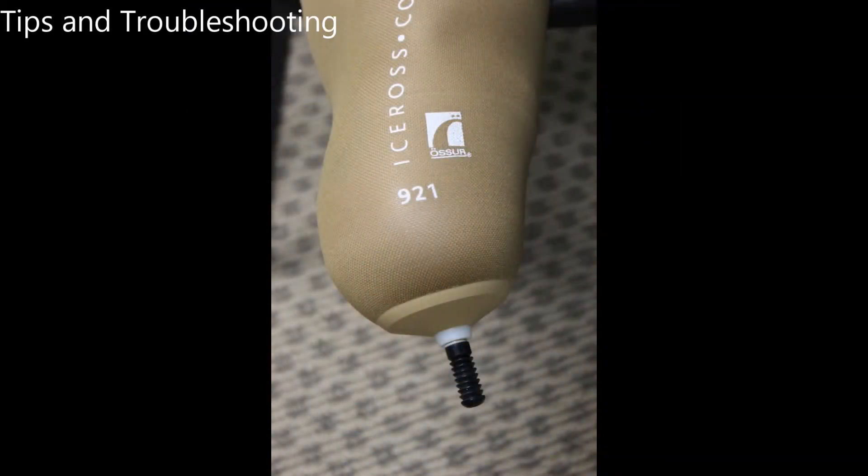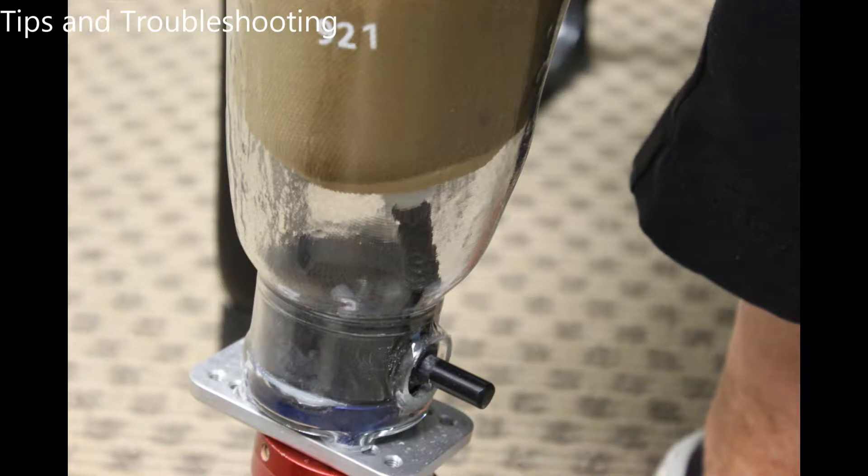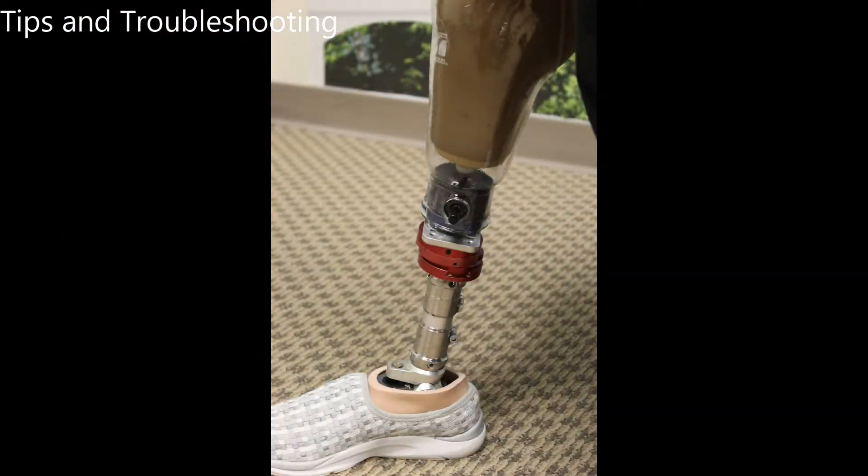If you roll on your gel liner with a pin misaligned with your leg, it is likely that the pin will not engage with the lock. This can be very frustrating. In our video, we are using a clear test socket to demonstrate this, but in your finished prosthetic you will not be able to see if this is occurring. If you can't get any clicks and the prosthetic is not too tight, it is likely the pin is stuck on the edge of the lock mechanism. You will need to remove the gel liner and place it on your limb with the pin perfectly straight in line with your leg.